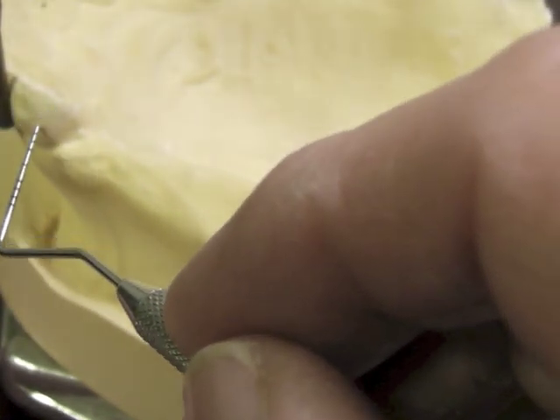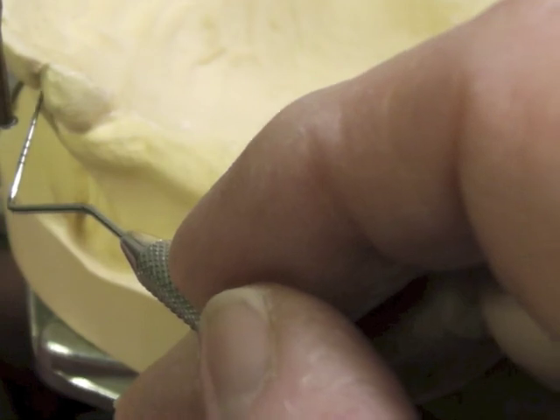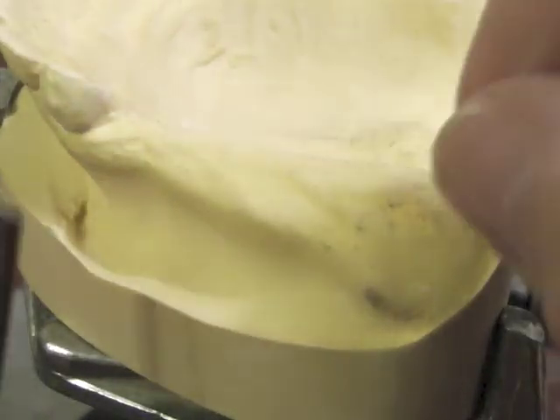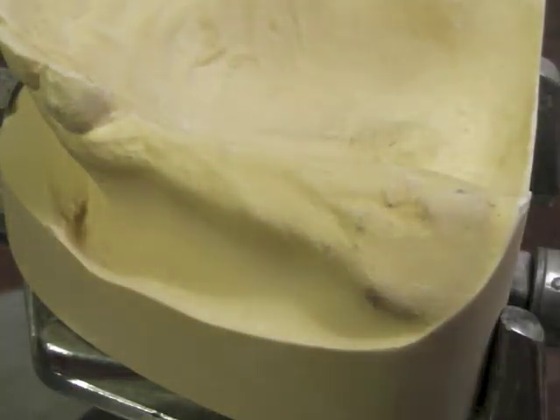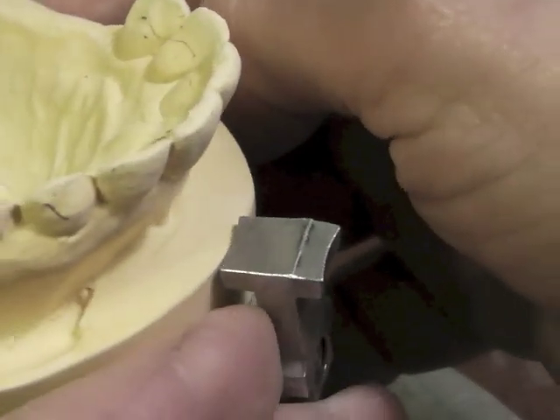The cast round clasp has to be all above the survey line, and then the terminal third goes below the survey line. The wrought wire clasp can come down and go under the survey line at least half of its width so as to be effective on that particular tooth. So at this particular orientation I have options of the cast round or the wrought wire.